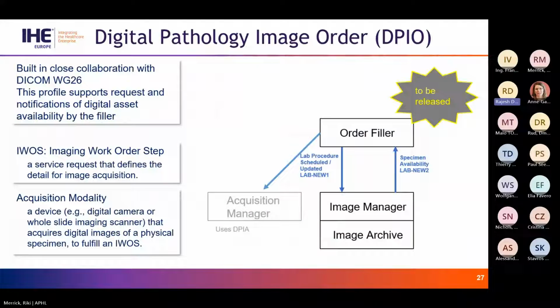Okay, so just a pictorial representation of what I just said. There are some established transactions, but I think we're going to have to modify them in order to have this communication. We are working closely with DICOM Working Group 26 to make sure that we're doing this in a way that's fully supportive of the underlying standard. Hopefully we'll have something available to show by the summer. Next slide.